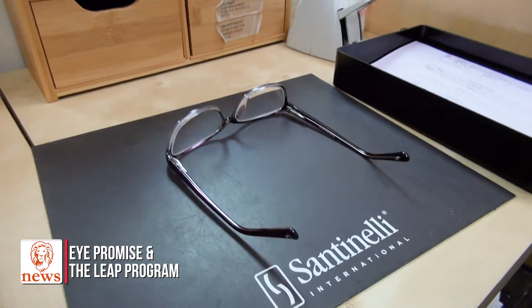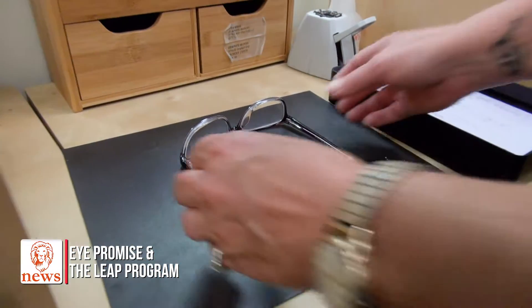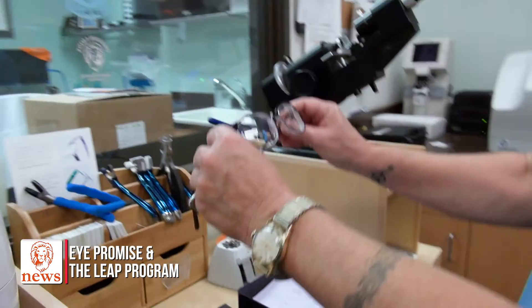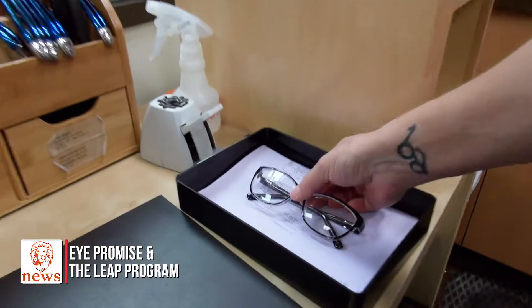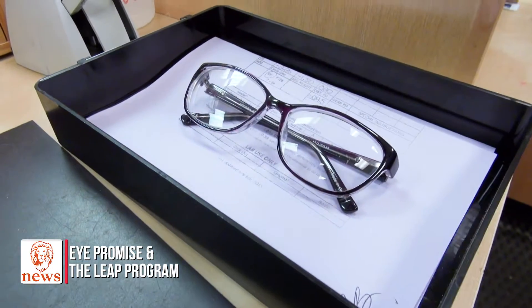We just quality checked the glasses so we can put them on our patients' faces for the best clear vision. What we do in this lab, we want the best quality going out on everybody's face because we take pride in what we do back here. Thank you for joining us and letting us share how we make our eyewear for our LEAP and iPromise clients — we really hope you enjoyed it.